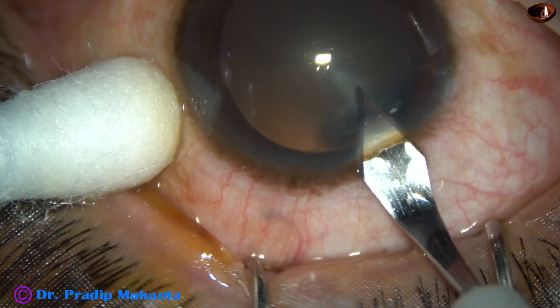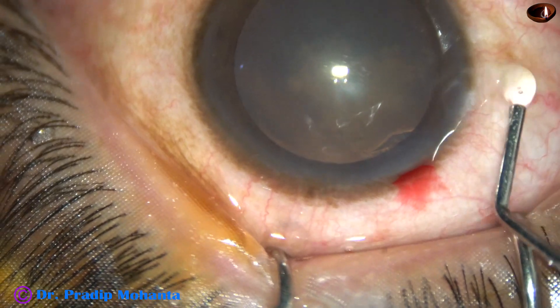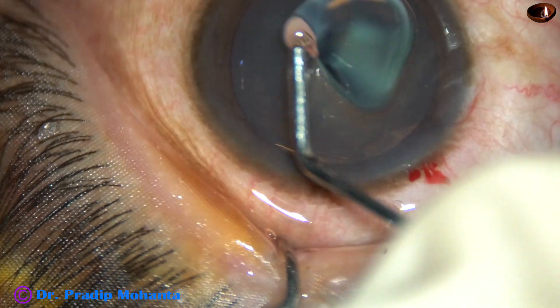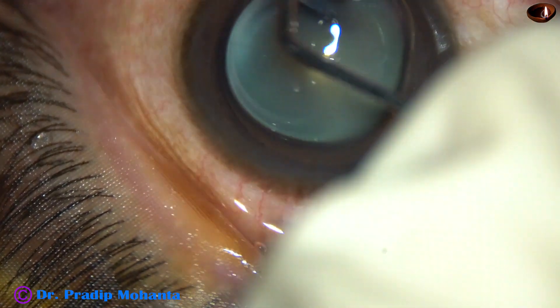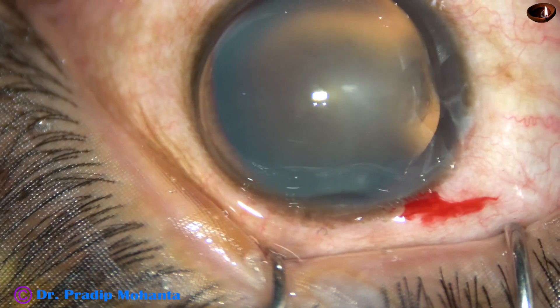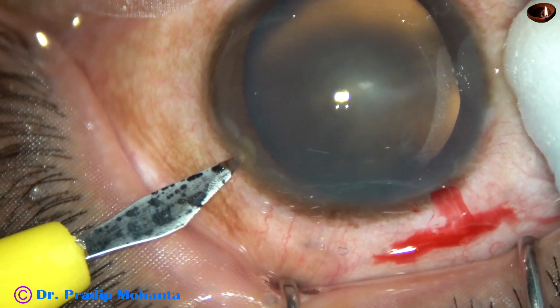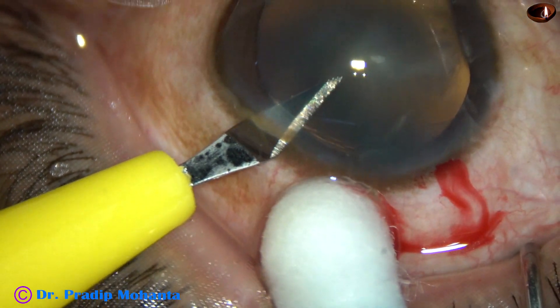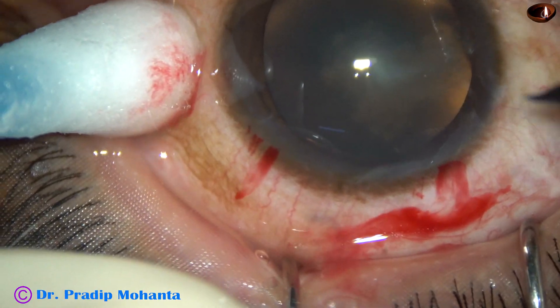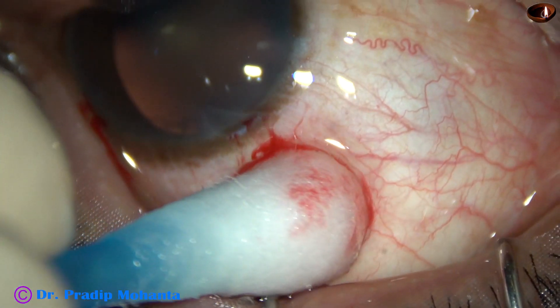This is the main incision with a 2.8 mm steel keratome on the posterior aspect of the limbus. Now 2% HPMC is injected into the anterior chamber. HPMC is applied over the corneal epithelium for better visibility. And now this is a side port on the left side of the main incision, and another side port on the right side of the main incision.